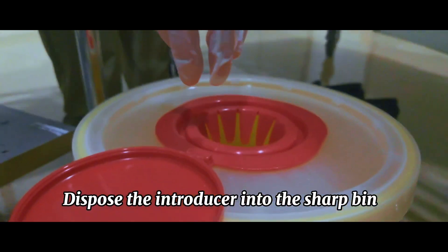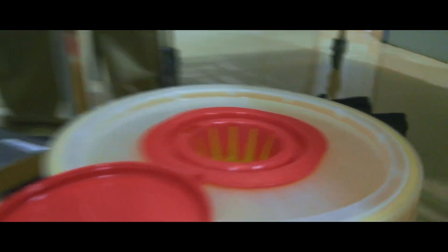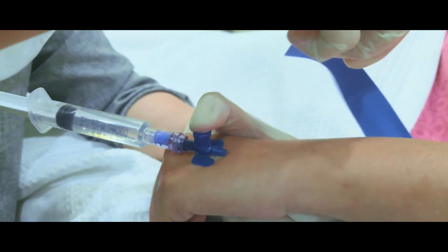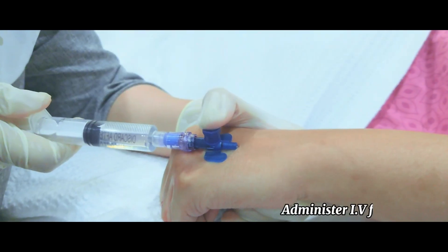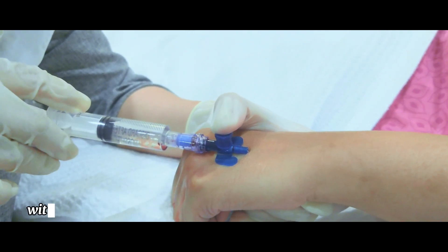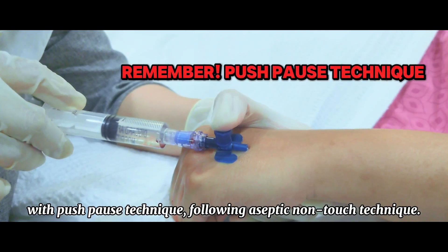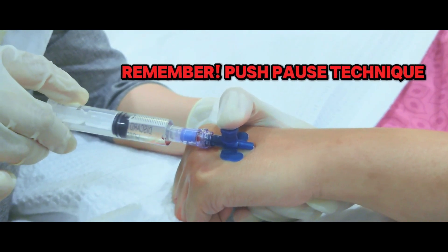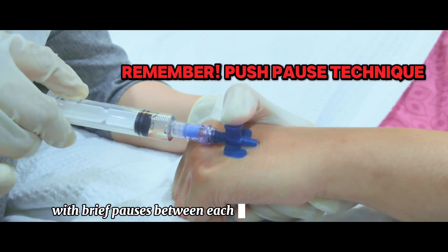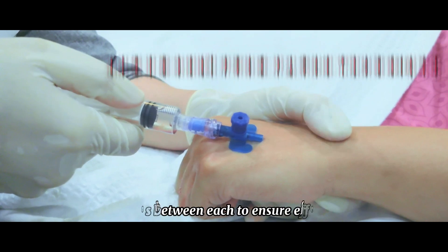Dispose of the introducer into the sharps bin, then attach an extension set or needleless connector. Administer IV flushing using 0.9% normal saline with the push-pause technique, following aseptic non-touch technique. This involves delivering 10 short boluses of 1 ml solution with brief pauses between each to ensure effective flushing.